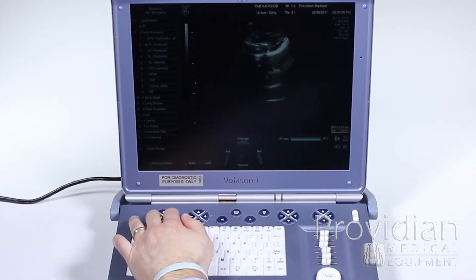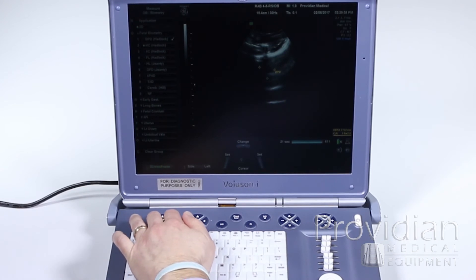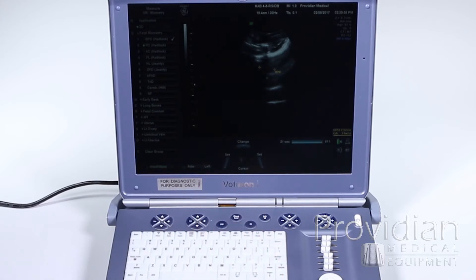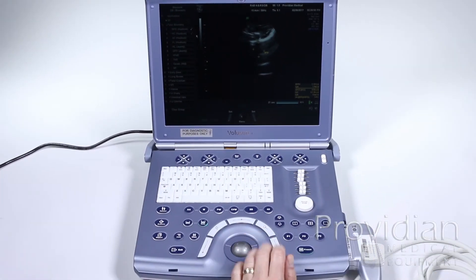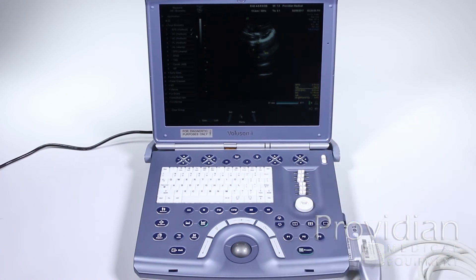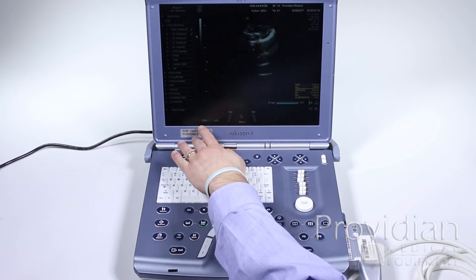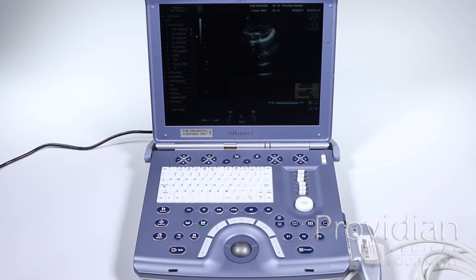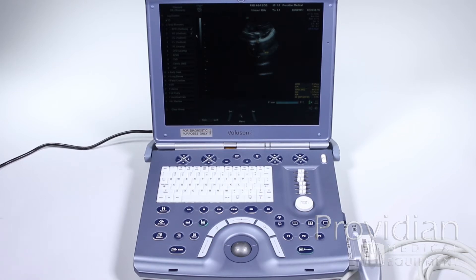I can use these to change how that trace is made — if I want an ellipse, an area trace, or points. I kept it on the area ellipse and then it saves my calculation and also gives me my percentages down at the bottom. It also says left or right side, which is more for other types of calculations where you're measuring something on the left or right side of the body. For general OB you won't be doing that.